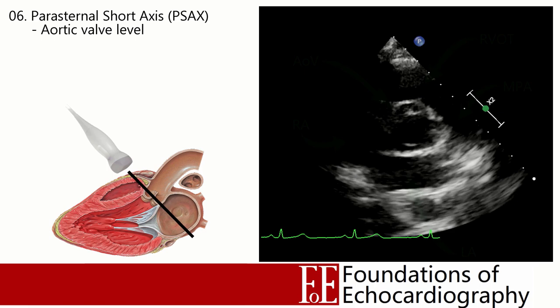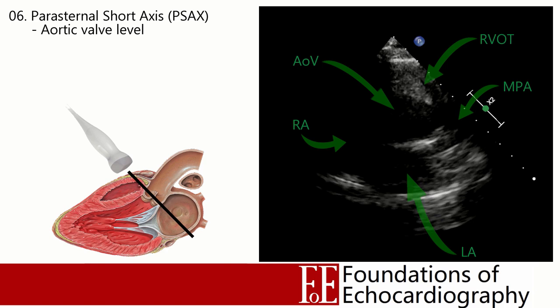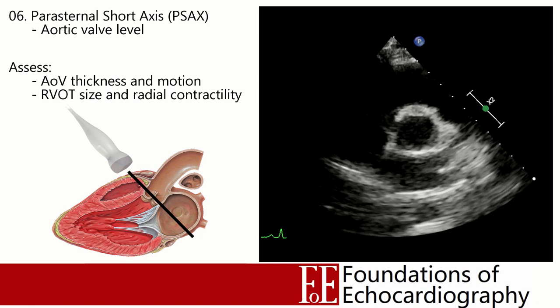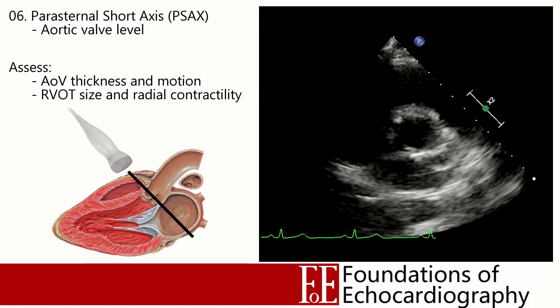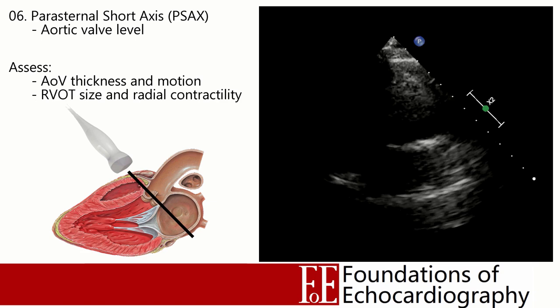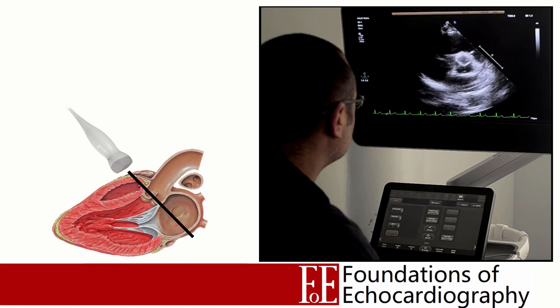In the parasternal short axis at the level of the great vessels, the aortic valve with its three cusps is in the centre of the image. Anterior to it is the right ventricular outflow tract, with the tricuspid valve on the left and the pulmonary valve on the right, and the left atrium in the far field. We can inspect the aortic valve leaflets for thickness and motion, assess the right ventricular outflow tract diameter, and get a sense of RV radial contractility. In severe right ventricular failure, the distance between the RV free wall and the aortic valve remains static throughout the cardiac cycle.